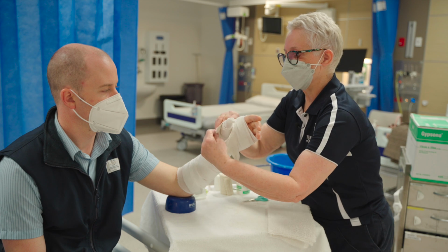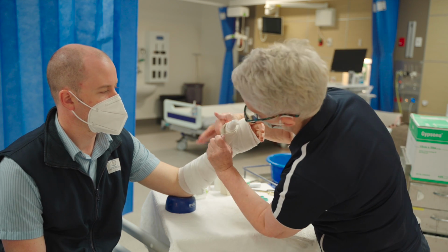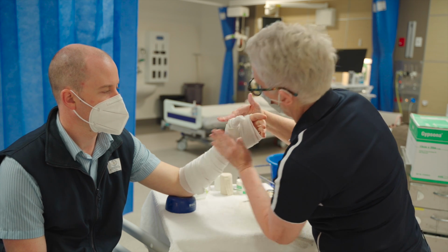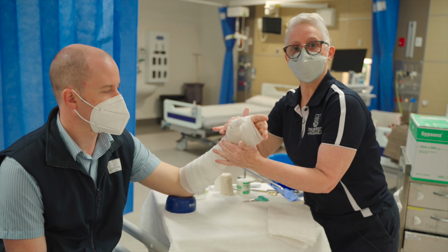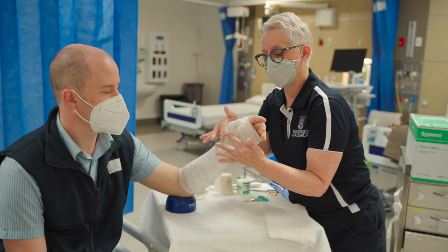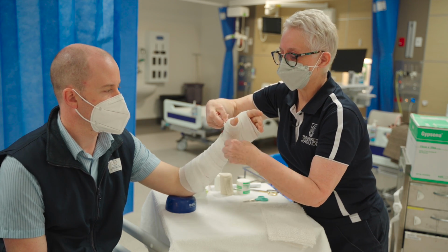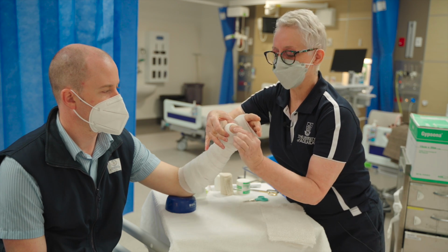The reason we're doing this type of splint is that we just want that little bit more thickness through here, just to give it a bit more strength. So we just want a little bit more strength through the base of the thumb here, so that's why we've done that. You may as well, while you're here, just take that stocking down and make sure the thumb can bend.